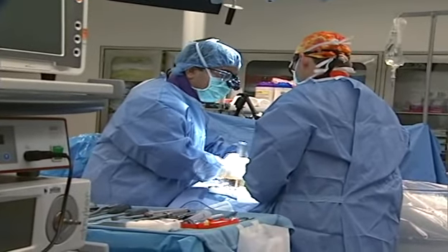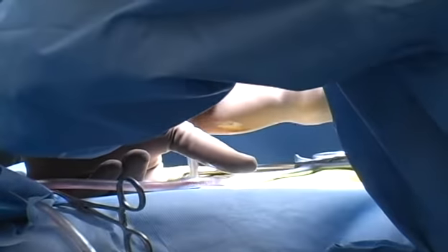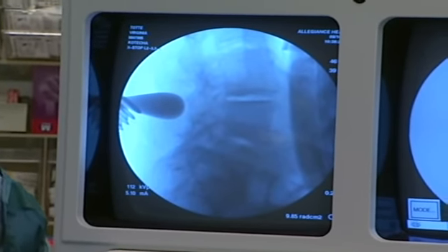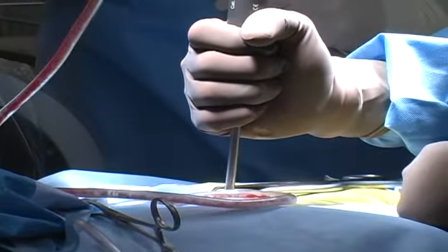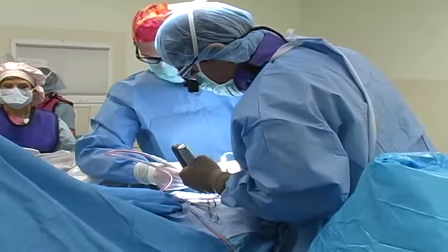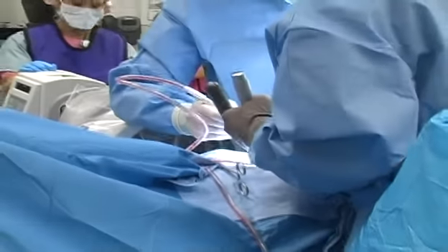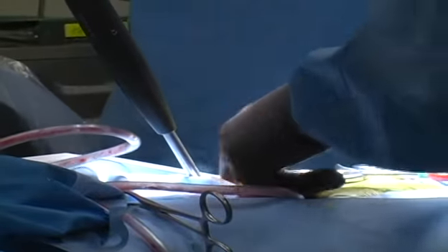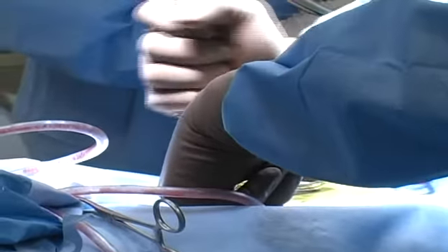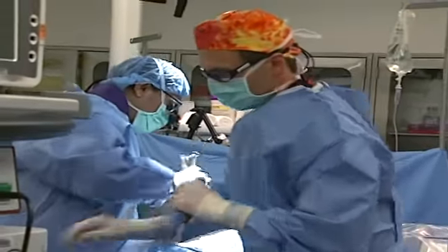What I'm doing is creating a space for me to put the XSTOP device, which is going to be right between the fins, so to speak, of the spine. That's where the device is going to get wedged. On, please. So what you have to do is create a little path for that device to be set. The device is not screwed into the bone, so it actually moves around, and it's free to move around. So that's the advantage of it. It's not a fusion operation, and it actually gets retained by the ligaments.